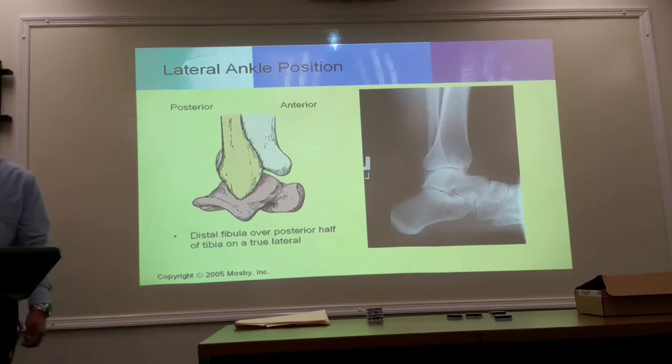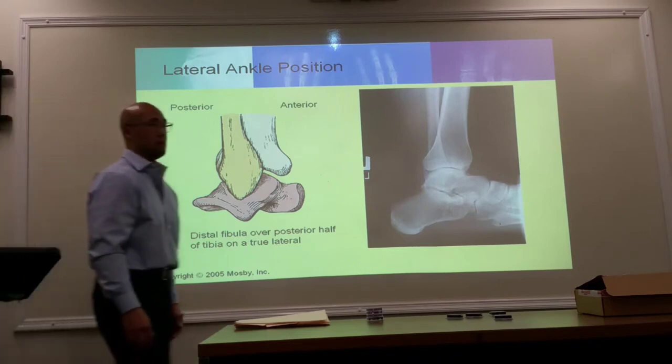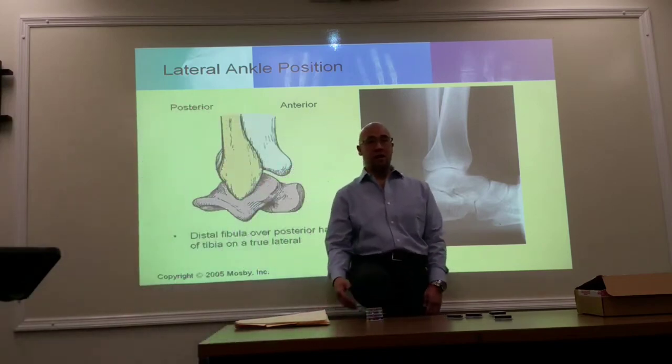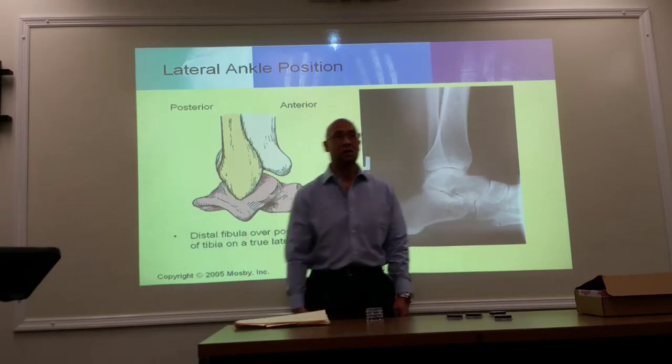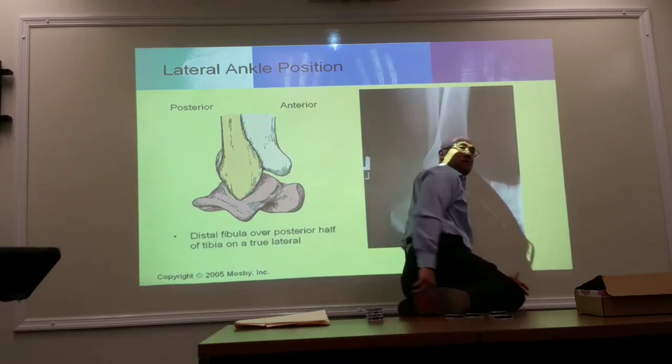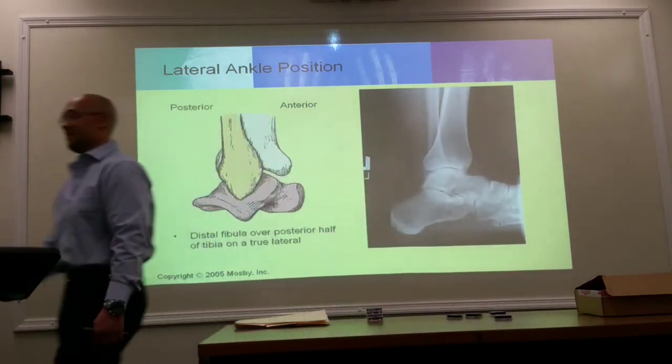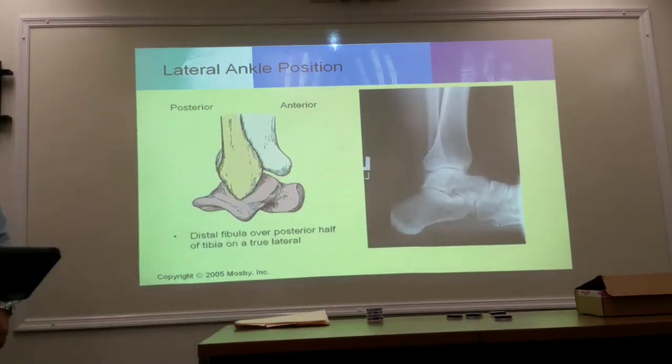Were there questions? Is that a lateral medial projection? It is going to be a medial lateral projection. When you're doing an ankle, it's a lot easier to frog leg your leg out this way to do a lateral than having to do it this way to do a lateral. I should have worn my spandex.